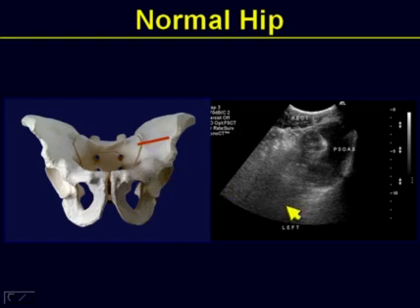So here in grayscale imaging, you can appreciate the bone acoustic landmark of the inner portion of the iliac or innominate bone. And as you could now notice, at the level of the higher portion of the iliac bowl, you now see the hypoechoic psoas muscle, or iliacus in this case, and of course the musculotendinous junction of the iliopsoas proper of the left hip and pelvis.